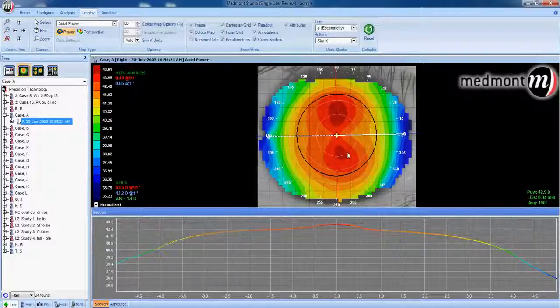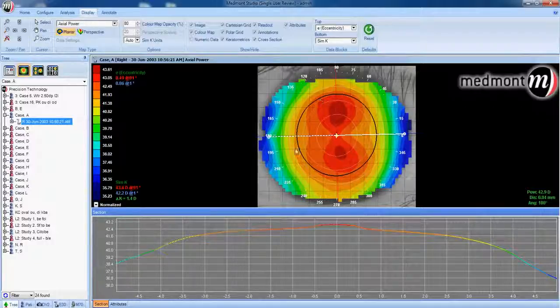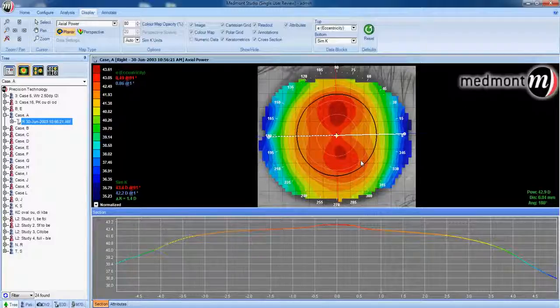We could look at the 3 millimeter, 5 millimeter, and 7 millimeter white rings and the pupil, which is shown in black. We can use either the pupil or the rings to determine the position, shape, or size of any anomalies in relationship with the visual axis, with the pupil, or to a certain diameter away from the apex.